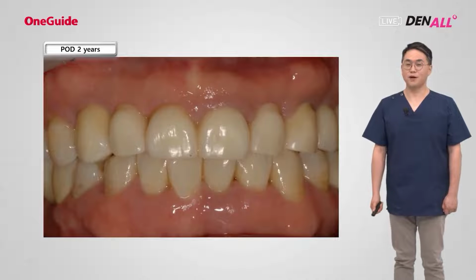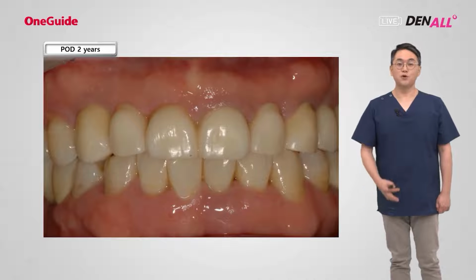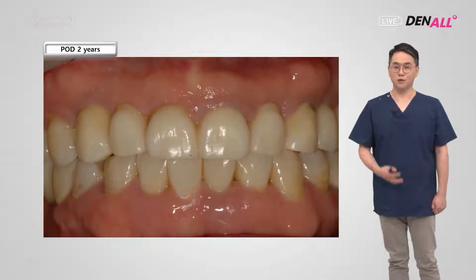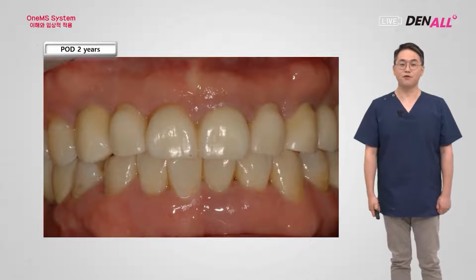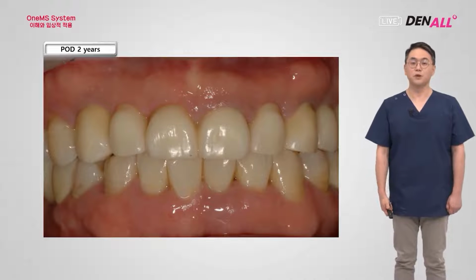Now, I'm following up to 2 years, and as you can see, there's no gingival recession. Of course, the gingiva biotype of this patient was thick, but even for a thin biotype, I think guided surgery is very much needed. No problem exists for this patient. The aesthetics are very good. The patient is also very satisfied.